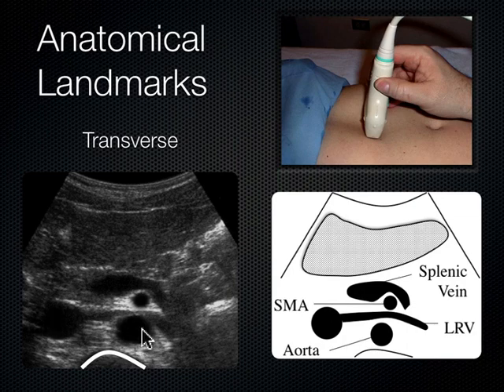Now, moving anteriorly, what vessel is this right here? It's bringing blood out to the intestines. It's a branch off the aorta. It's called the SMA, or superior mesenteric artery, and it looks like a mantle clock over here. Now, realize that you guys haven't had anatomy yet. I totally appreciate that, and I know I'm kind of getting the cart before the horse, but you're going to learn it eventually. You may as well get a taste of it. This is the mantle clock, the superior mesenteric artery, which I think looks like a mantle clock.